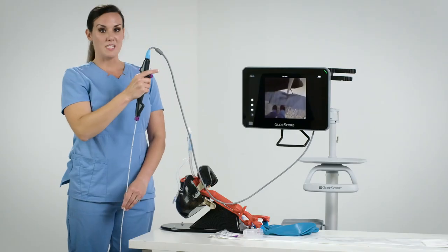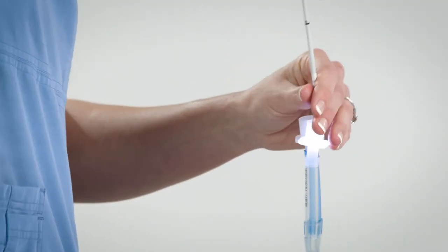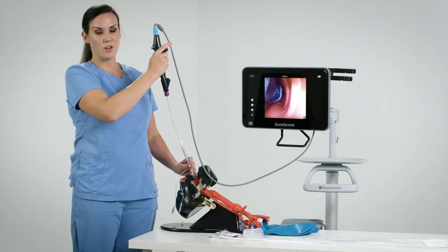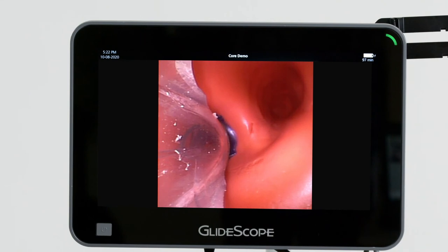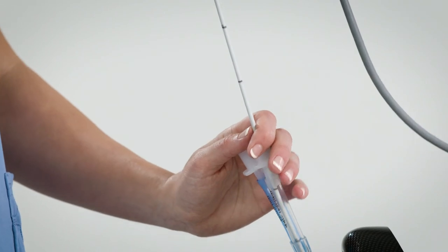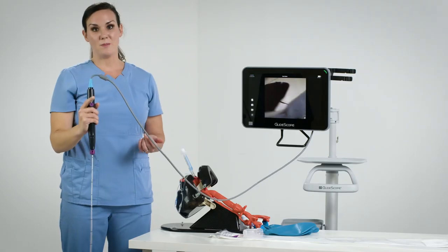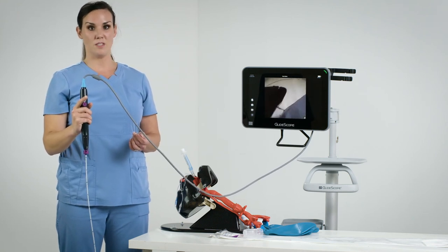To confirm position of the endotracheal tube, I'm now going to advance the scope down the tracheal port and I can reposition the endotracheal tube as needed to get it in the appropriate place. Now my endotracheal tube is appropriately positioned and I can remove the B-Flex scope from the double lumen tube slowly, retracting it and keeping it in neutral position. Now the patient has been successfully intubated and the placement of the tube has been confirmed using the B-Flex scope.